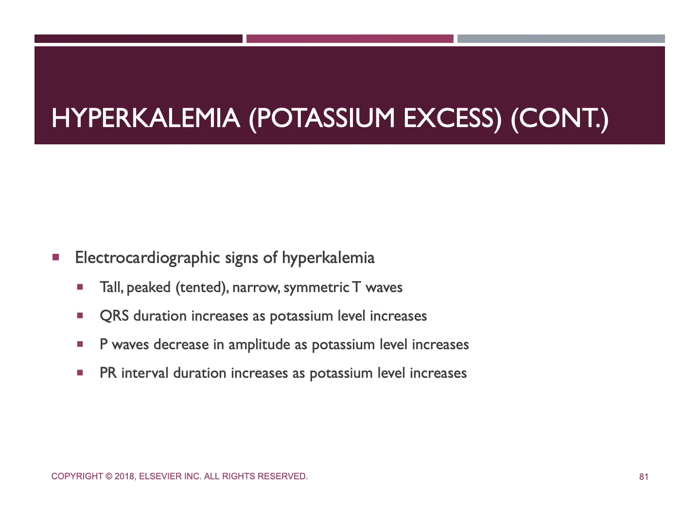When it comes to the effects of hyperkalemia, it's really going to depend on the tissue that's involved. The atrial myocardium is the most sensitive to hyperkalemia, the ventricular myocardium is less sensitive, and the SA node and the bundle of His are the least sensitive of them all. When the potassium level exceeds 5.5 mEq per liter, tall peaked T waves may be seen on the ECG.